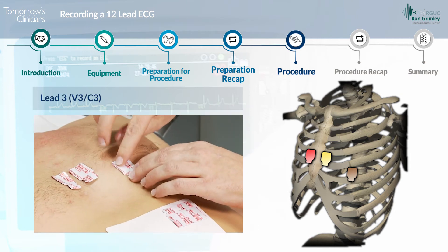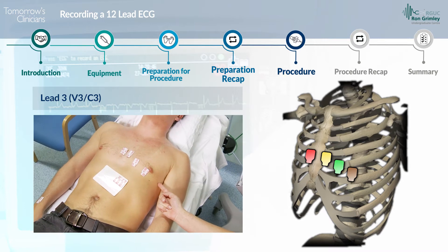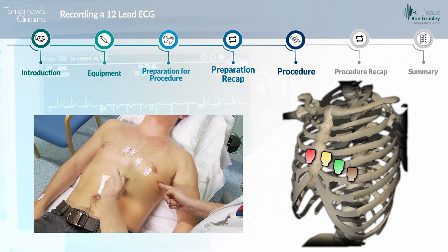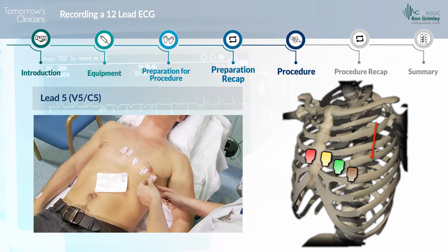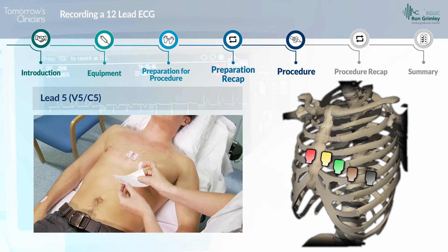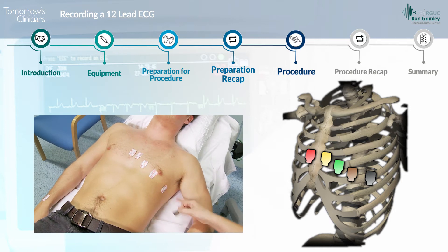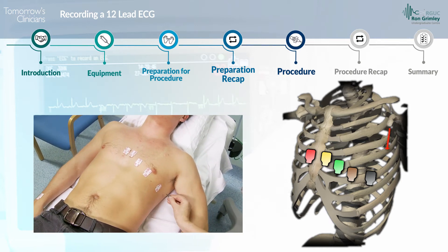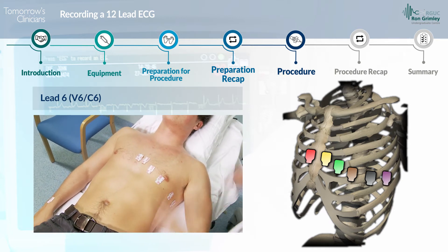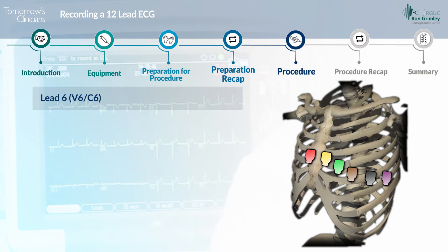For lead three, labelled V3 or C3, the electrode is located midway between V2 and V4. For lead five, labelled V5 or C5, the electrode is located at the left anterior axillary line on the same horizontal plane as V4. For lead six, labelled V6 or C6, the electrode is located at the left mid-axillary line on the same horizontal plane as V4 and V5.